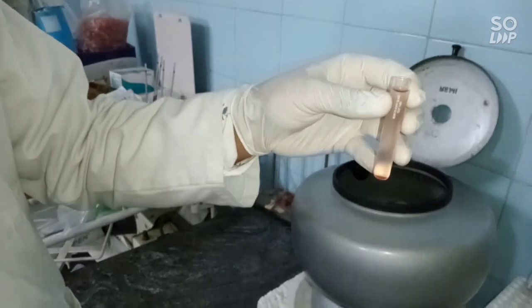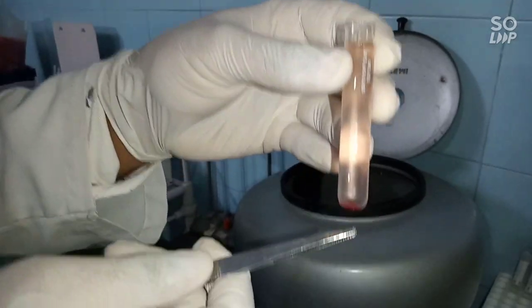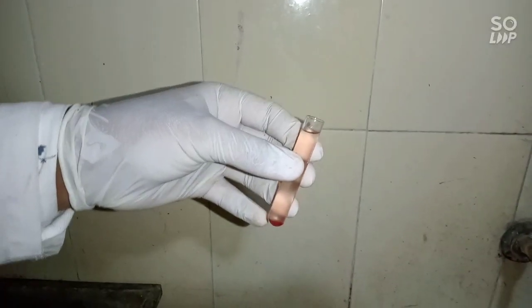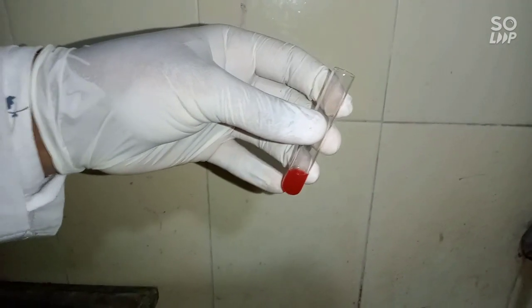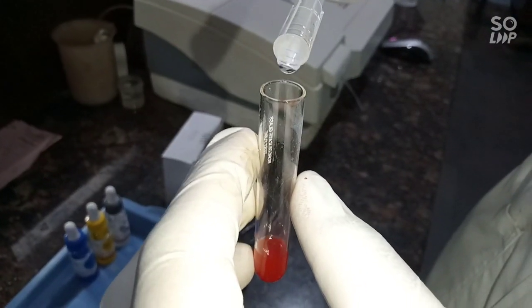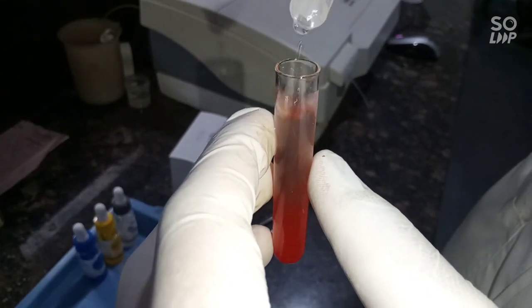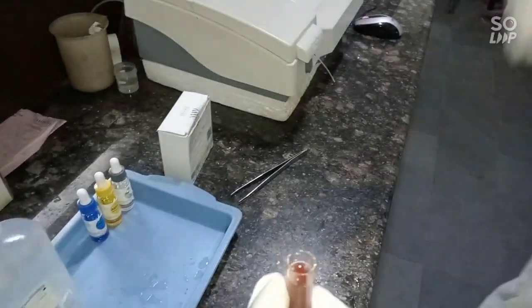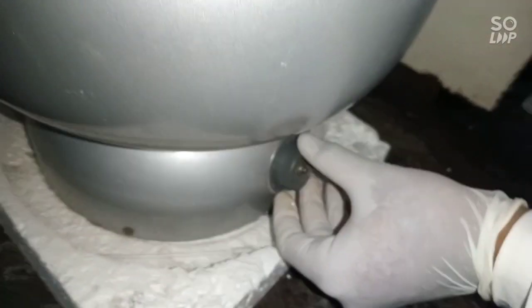Take a look at the tube — this is the supernatant and this is the sediment. Then refill the tube with normal saline. This is the second wash. Repeat the same procedure one more time and start the centrifuge at 2,000 RPM for one minute.